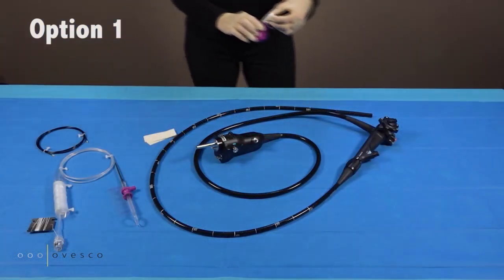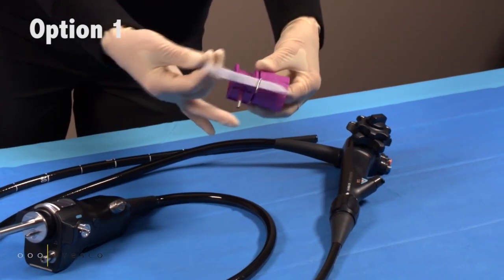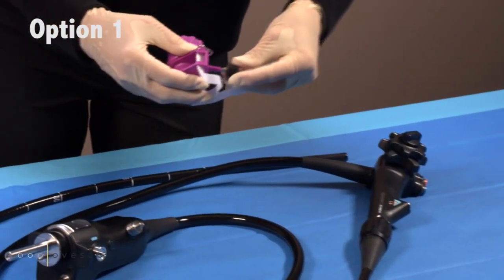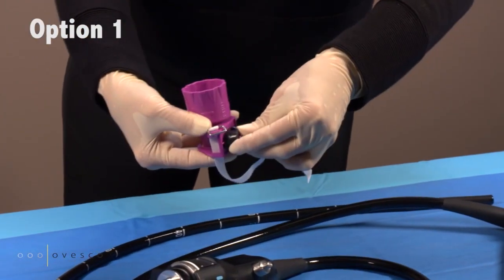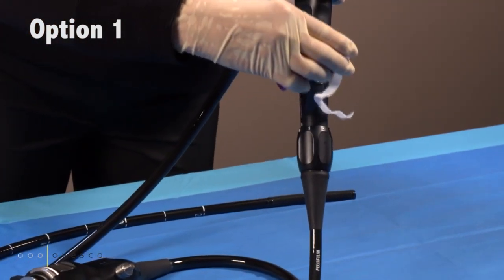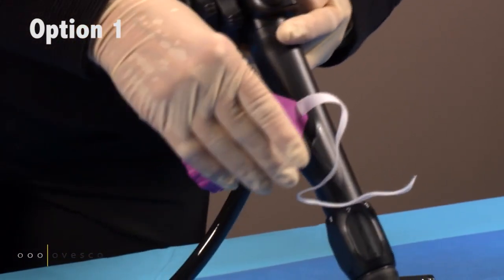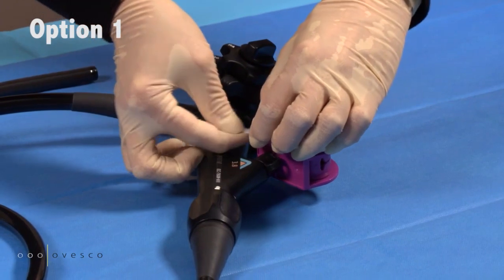Mount the hand wheel on the working channel of the endoscope. Attach the hand wheel's velcro strap to the endoscope's handhold.